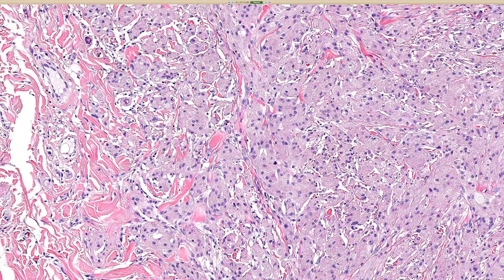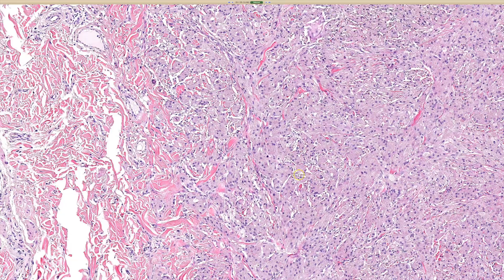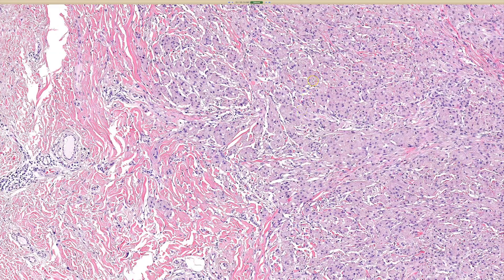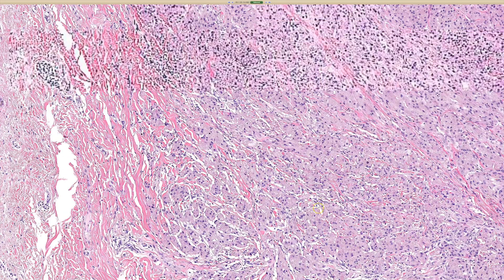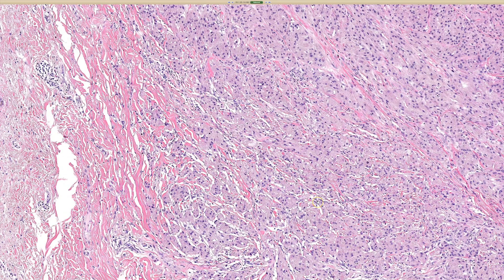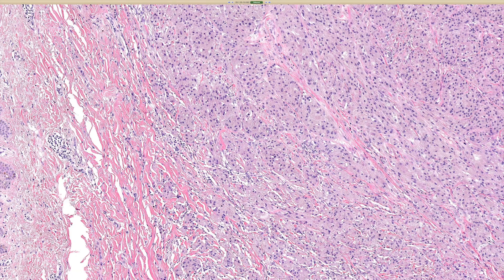These look like histiocytes, but what kind of cells are these actually? They are Schwann cells — which is surprising because they don't look like Schwann cells. This is actually a nerve sheath tumor. It will stain with S100 and SOX10, and it will also stain with CD68, which is a marker that histiocytes stain with, but it's not a specific histiocyte marker.